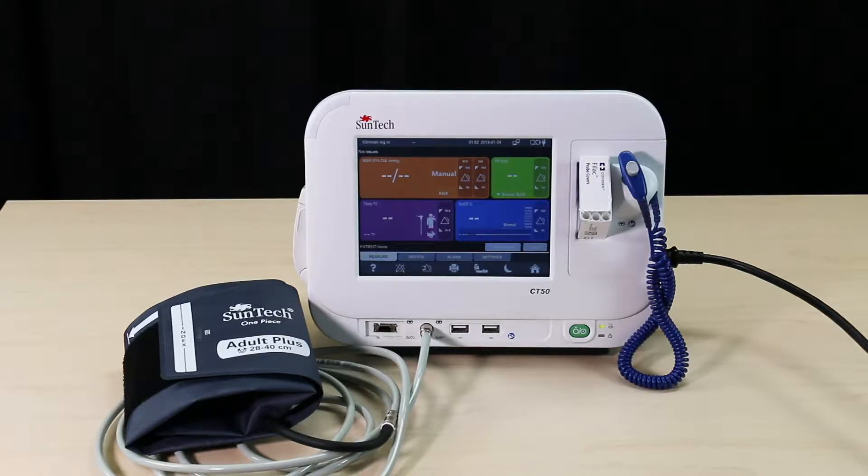To take a non-invasive blood pressure measurement using the Suntec CT50, you will need the blood pressure cuff and hose connected to the monitor.